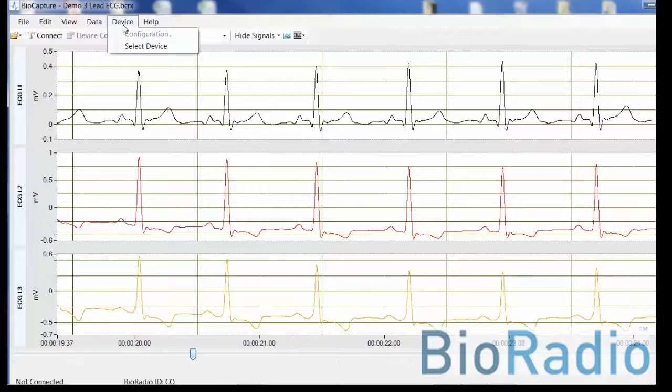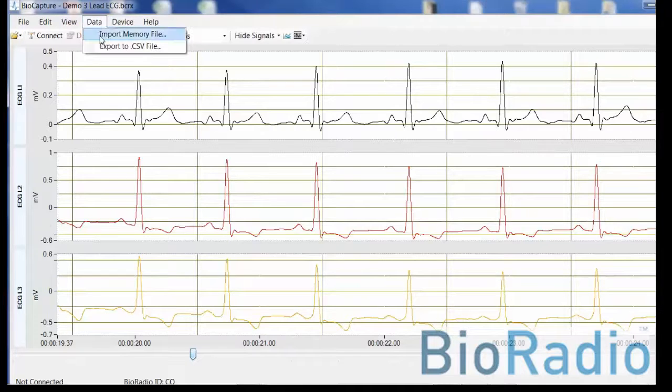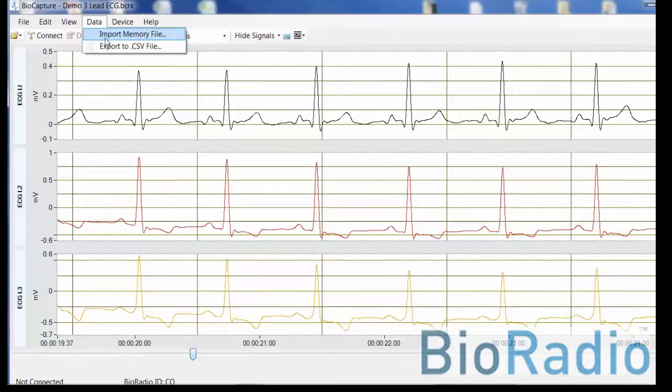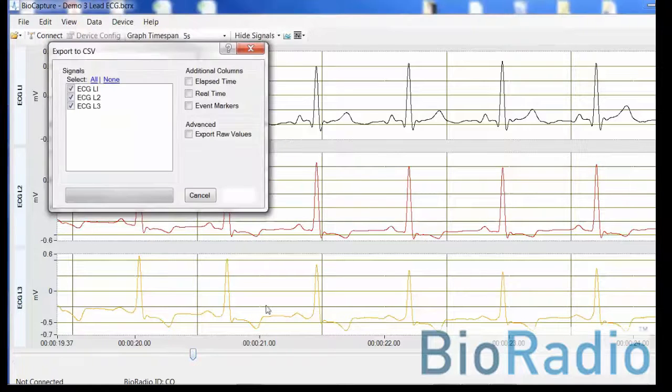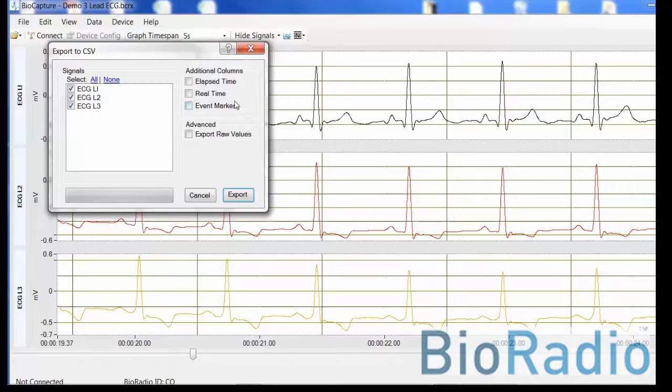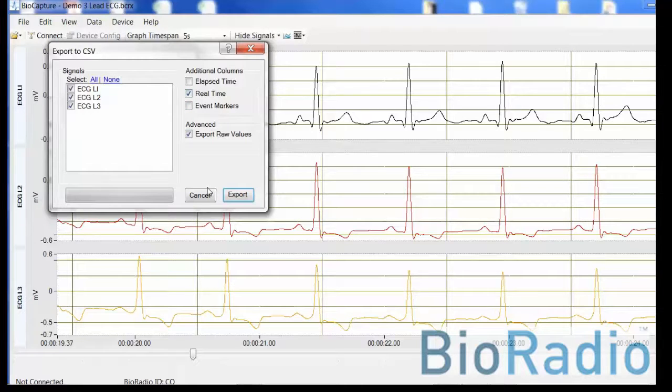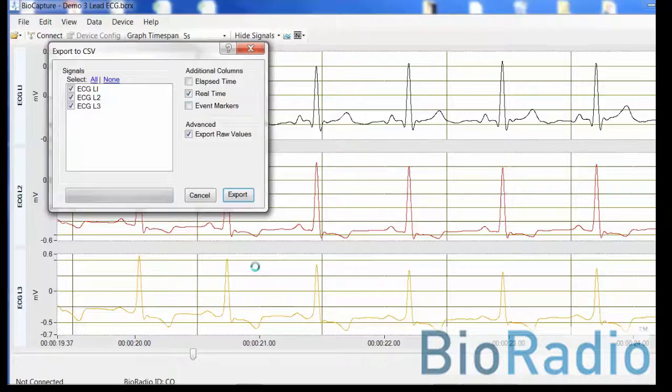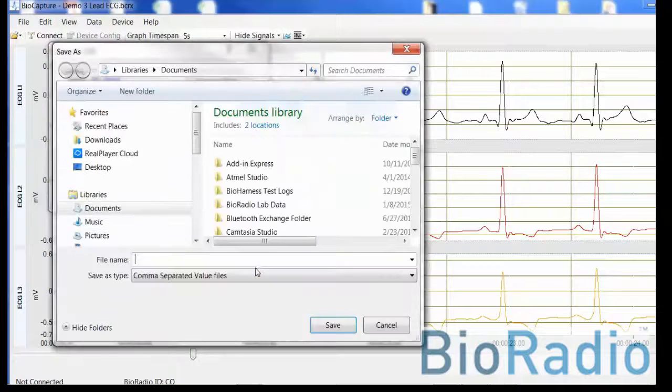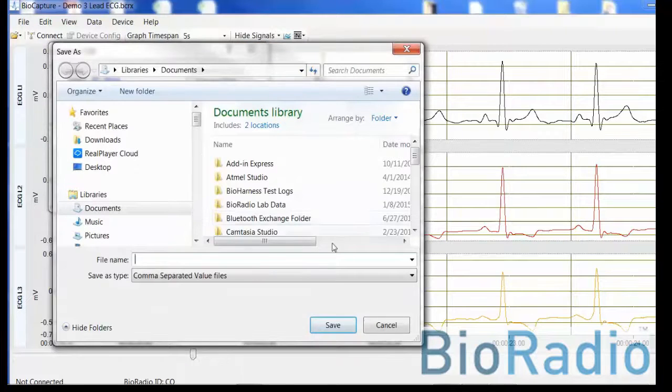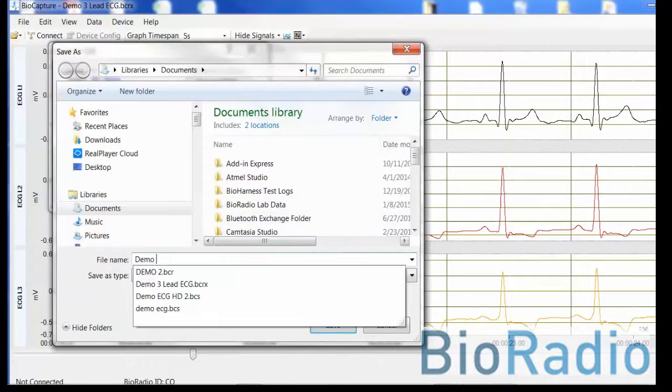If you select data, you can import files via memory mode on the BioRadio or you could export this file. The raw data, real-time information along with the embedded event marker on the BioRadio can be exported to a CSV file format.